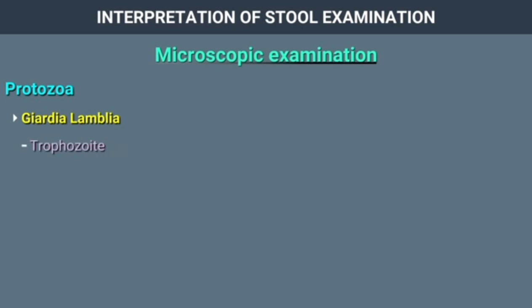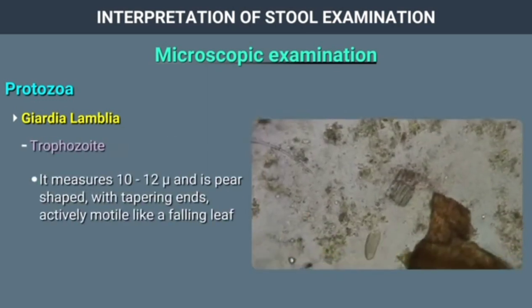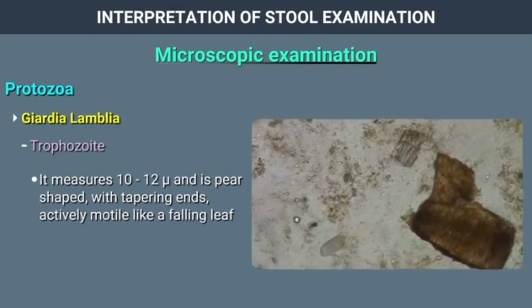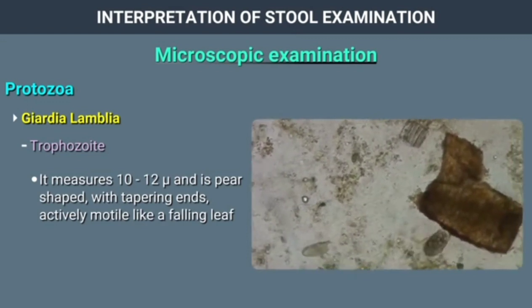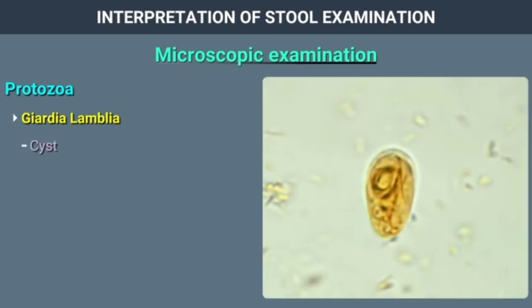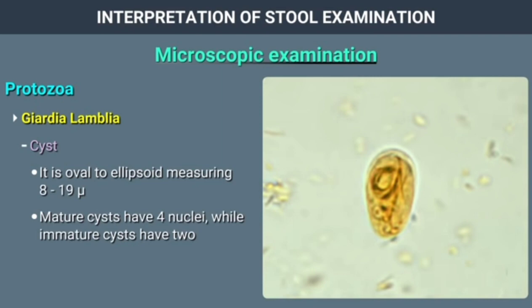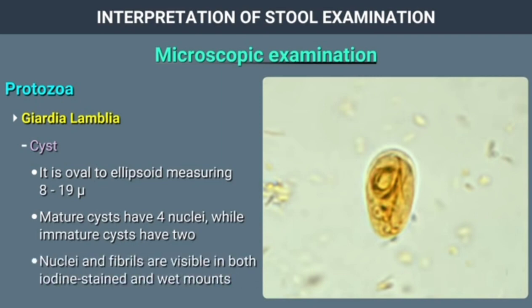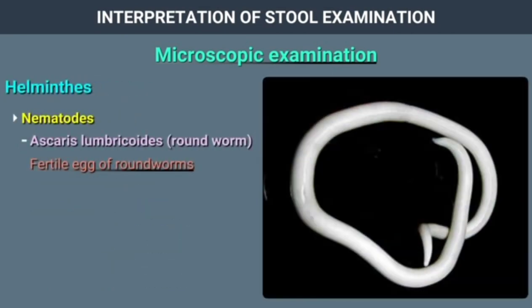Giardia lamblia trophozoite measures 10 to 12 microns. It is pear-shaped with tapering ends, actively motile like a falling leaf, and has 2 centrally placed nuclei and uniform granular cytoplasm. The cyst of Giardia lamblia is oval to ellipsoid in shape, measuring 8 to 19 microns. Mature cysts have 4 nuclei while immature cysts have 2. Nuclei and fibrils are visible in both iodine-stained and wet mounts.